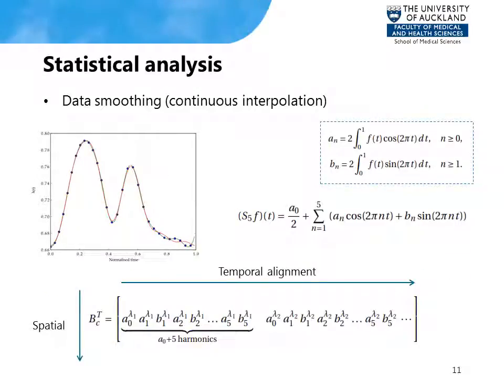If we look at one shape parameter over time, we can see how it varies along the now normalized time axis. Since we wish to find a continuous representation of this function, and since this function is clearly cyclical, we used its Fourier representation with 5 harmonics to contain the number of dimensions of the shape vector. Now, the shape vector B contains nearly all spatial and temporal information in an aligned or registered way suitable for PCA.